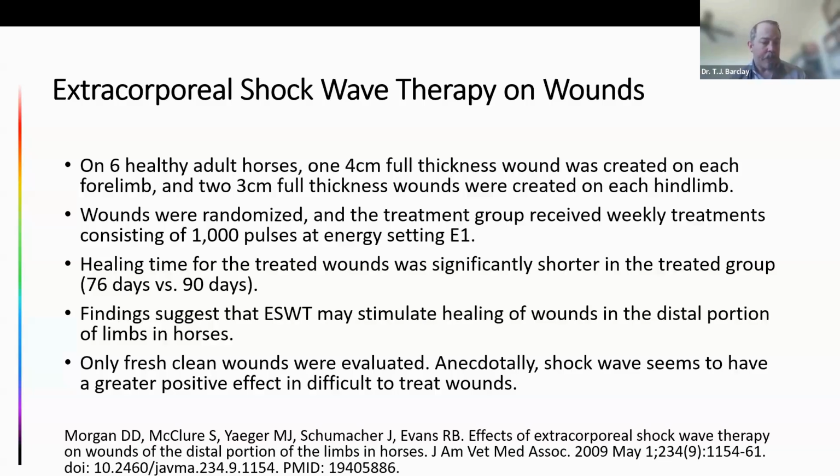And one thing to note in this study is these wounds, I mean, this was an ideal wound situation. The wounds were created very cleanly, and were really the ideal wound to try to get healed, and still the shockwave had an effect on the healing process there. And anecdotally, based on a lot of experience in the field, our typical contaminated wounds usually respond quite a bit better or have a more profound effect from the shockwave.